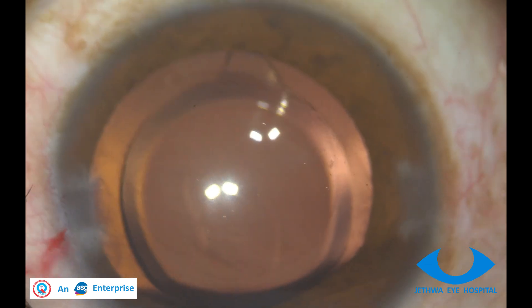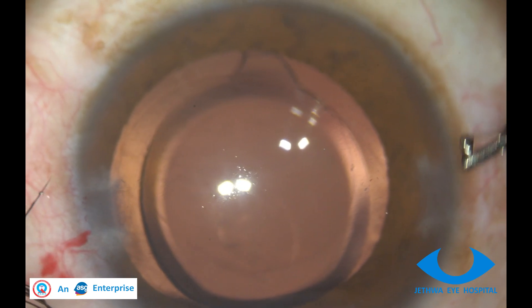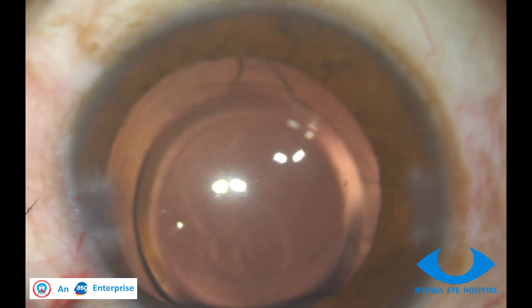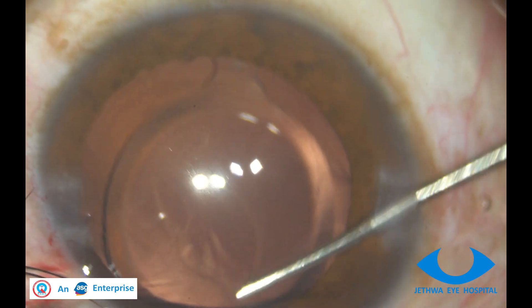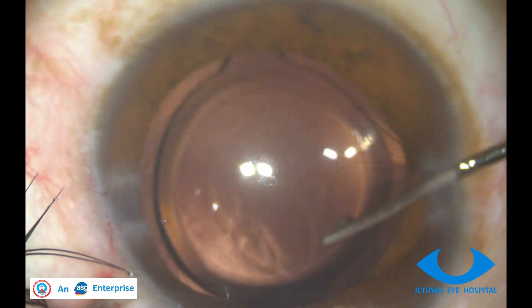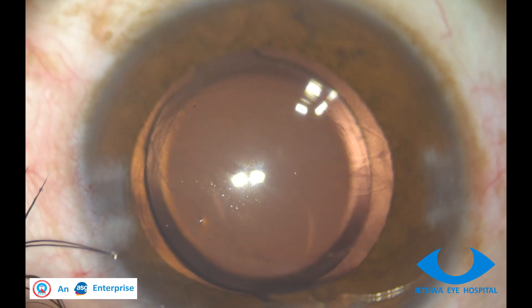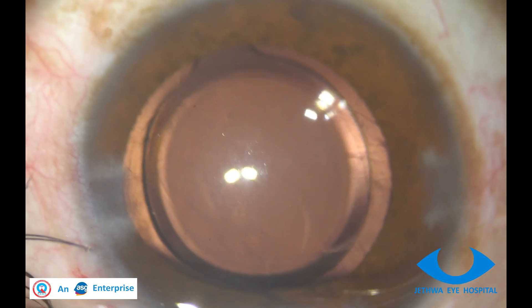Once it is confirmed that the chamber is deep enough, we can try to push the optic into the back. Here we should not do dialing of the IOL — instead we will attempt to flex the haptic rather than dialing. The optic in the bag is then confirmed.